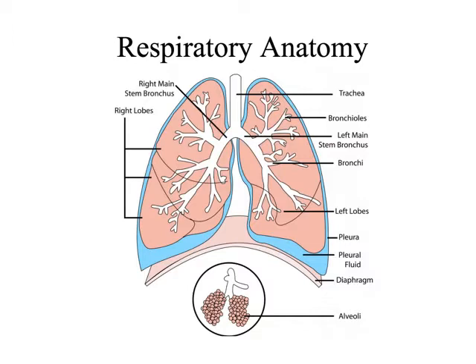So hypodense. And then, of course, in the right lung, we're going to have 3 lobes. In the left lung, we have 2. And these various stems and branches of the bronchi and bronchioles, we'll be able to identify those as well on these images.